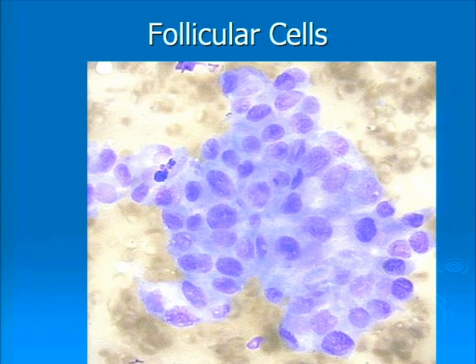So the important part about adequacy is finding clusters of cells, because remember, follicular cells and Hurthle cells are what make up the malignancies, right? So when we have other cells in there, if you have Hashimoto's thyroiditis, you can have macrophages, you can have lymphocytes, but those don't make up the malignant parts of the lesion, right? So you don't use those when you count cellularity. So the only cells that count are clusters of cells that are follicular or Hurthle in nature.